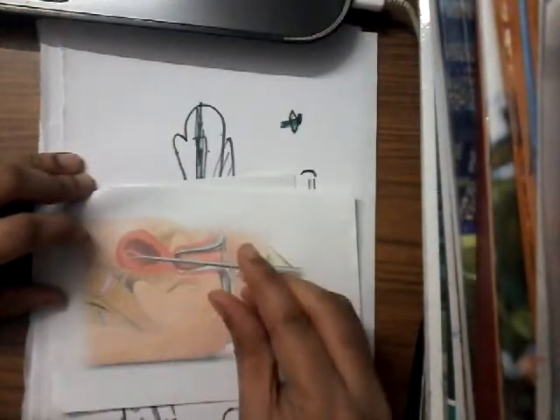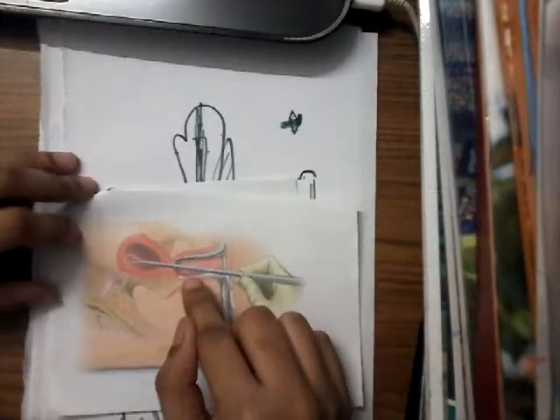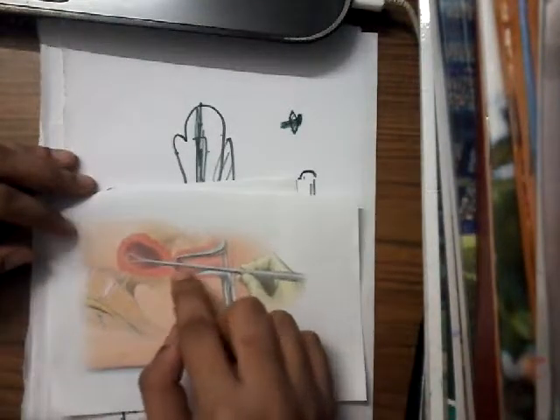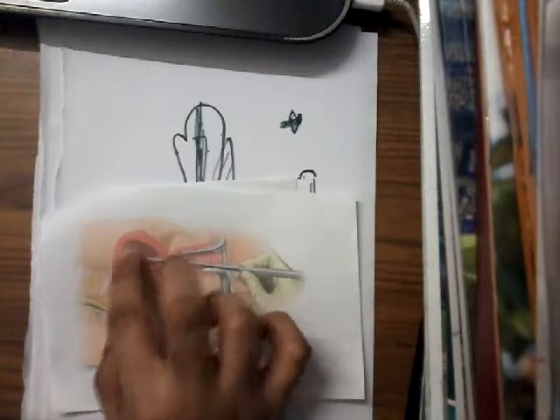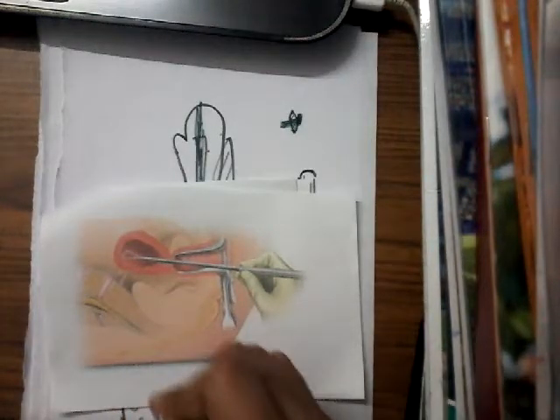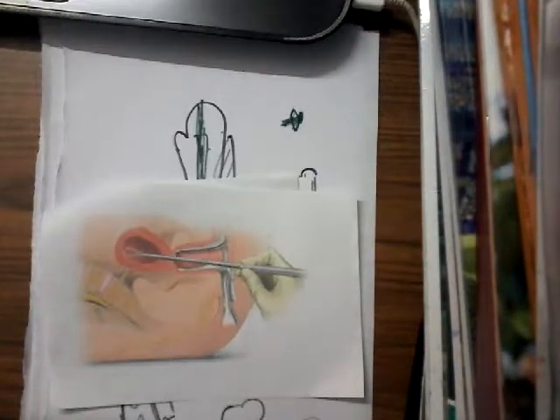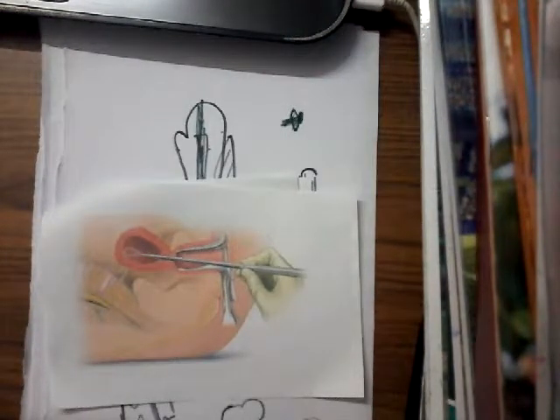The uterine curette is held in a pen-like fashion and introduced into the cervix and into the uterus. A small part of the endometrium is taken through the fenestration, and this endometrium is sent for biopsy for histopathological examination. This concludes the discussion on the uterine curette.